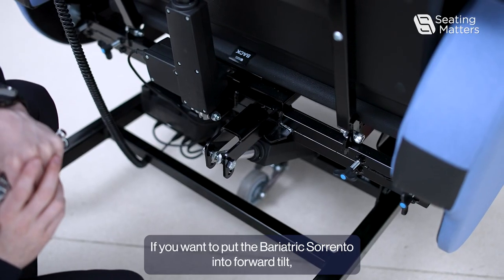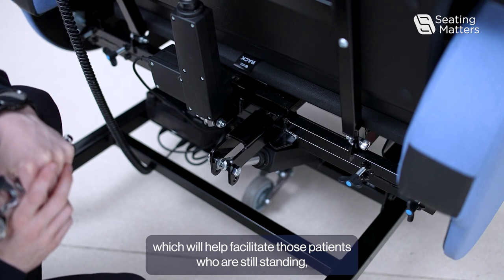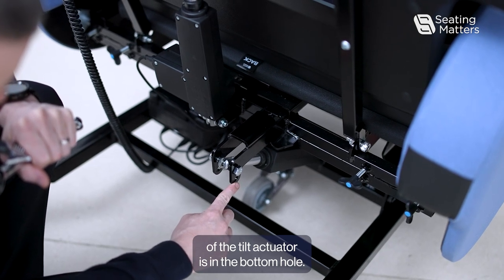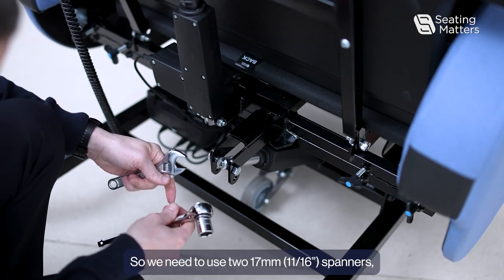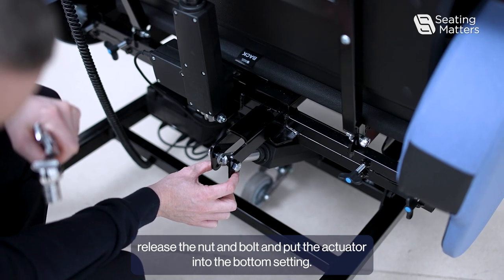If you want to put the bariatric Sorrento into forward tilt, which will help facilitate those patients who are still standing, we need to make sure that the setting of the tilt actuator is in the bottom hole. If it is in the top hole, you are not going to be getting forward tilt, so we need to use two 17mm spanners, release the nut and bolt, and put the actuator into the bottom setting.